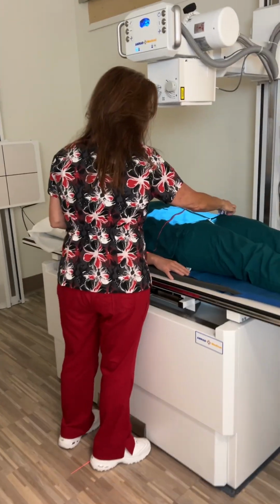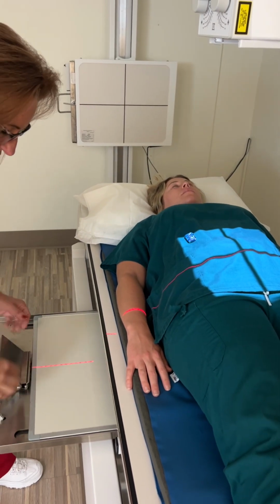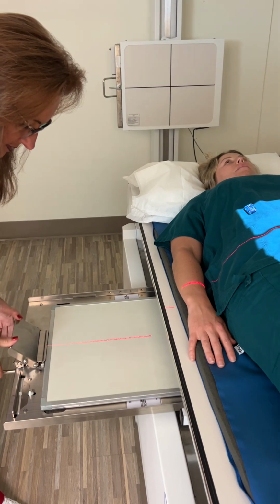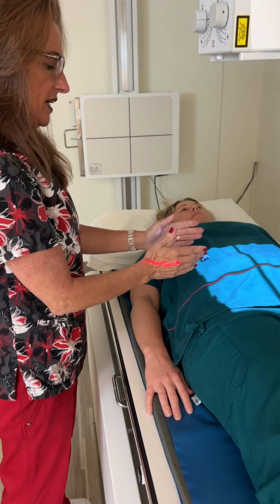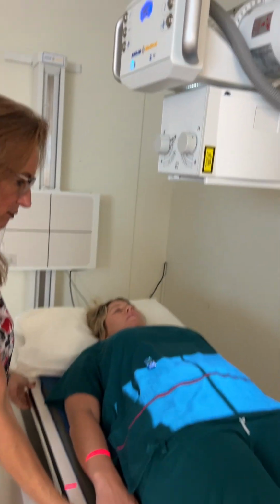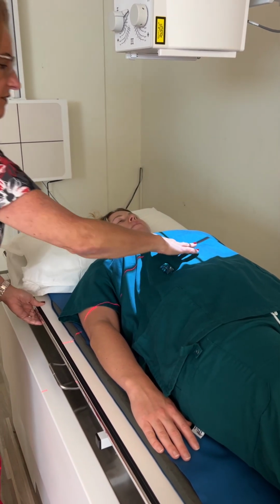Now this next one, what we're gonna do is what we would call a T-shot. So I'm gonna move my marker so that I can have overlap to show the radiologist that we did not miss anything. I'm gonna take this out and turn it crosswise. And then this area will give me, it'll be on the first image and it'll be on the second image, because I'm gonna change this to 14 by 17 crosswise. And then I'm gonna move my patient down so that that marker ends up in the bottom of the second image.